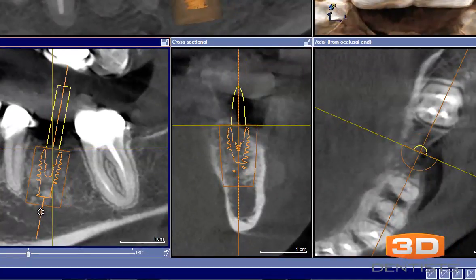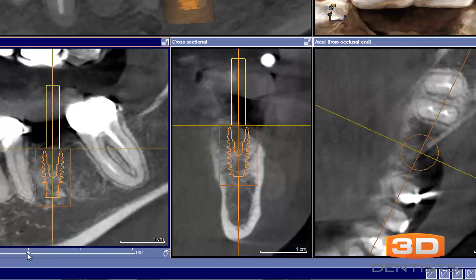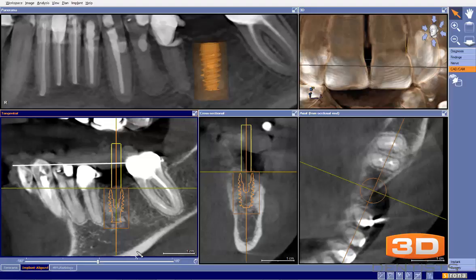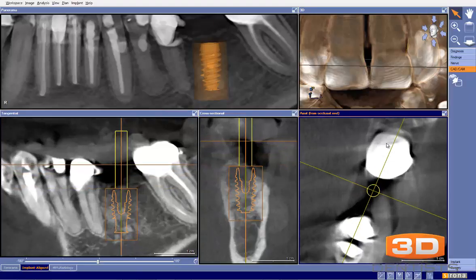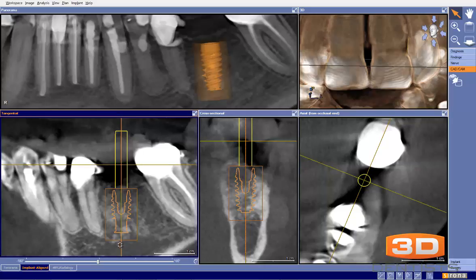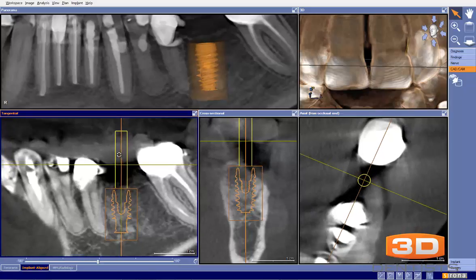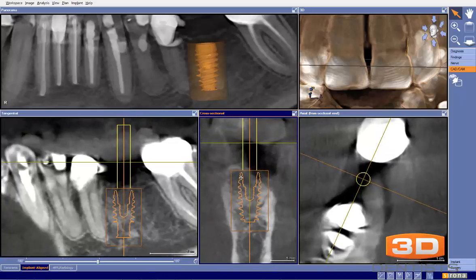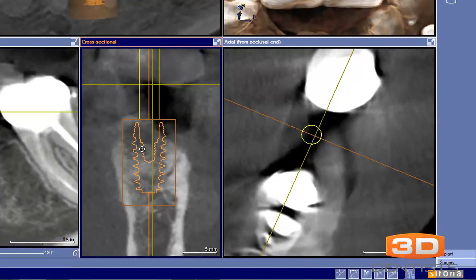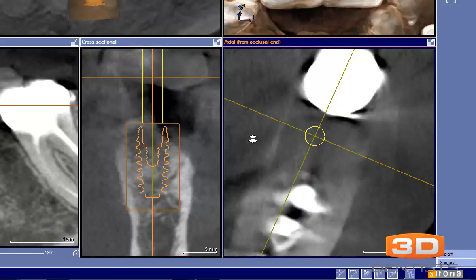To fix that, we would simply tilt the implant just like so, until we see this become a little bit flatter. Now we can see our occlusal plane is more normal, as we'd like to see. Also, looking at this in the axial view — because we tilted the implant, we're now too distal, so we need to move this over to the mesial a little bit and get that better centered. In terms of bone level, I would prefer to not place it exactly at the bone level requiring that much grafting, but somewhere in between — because when we do this type of surgery, there'll be some crestal bone resorption, so we want to account for that.